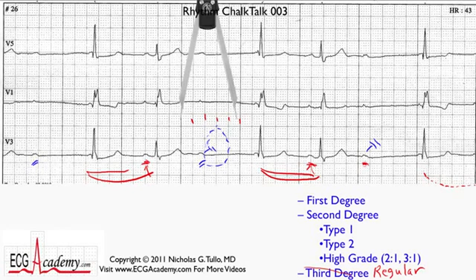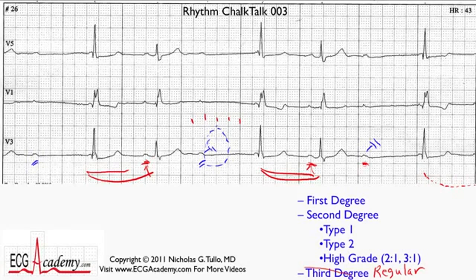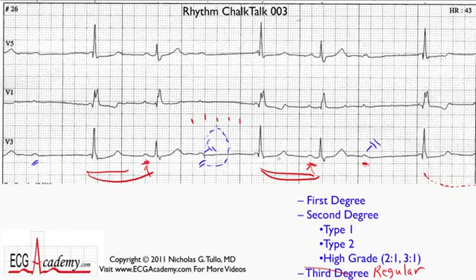So you have a sinus rhythm because the P waves appear to be upright — a sinus rhythm at 68 beats per minute — and some kind of AV block is going on. Here's an interesting way of telling which P waves conduct and which don't, because it can be a little deceptive sometimes.